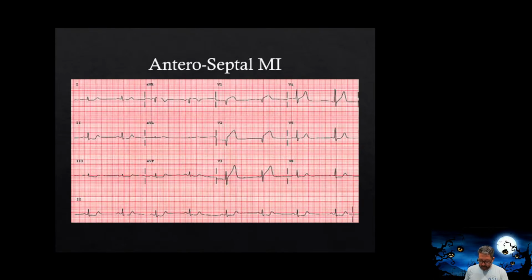Actually, I got some right here. Let's do some right now. Okay. Hope you didn't see those so fast. Okay, so just type in chat what you think this one is, and we'll go from there. It's an MI, because this is the MI lecture. I don't even know if we can do this. I don't know, the delay might be too much, but we'll keep it. It's anteroseptal. All that, all that.